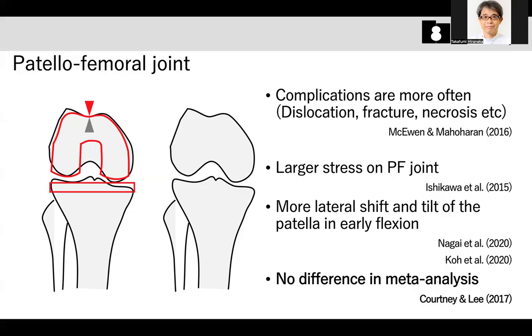If we insert the femoral component parallel to the PCA, the groove of the femoral component comes slightly more medial than the native groove of the femur.